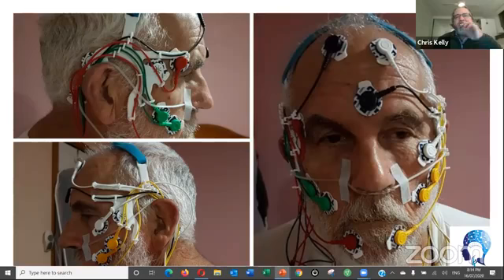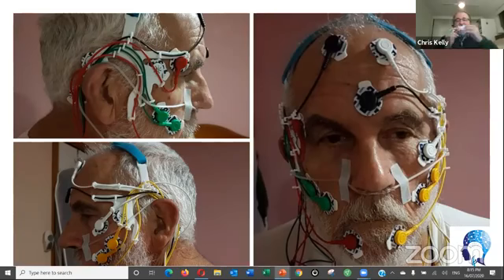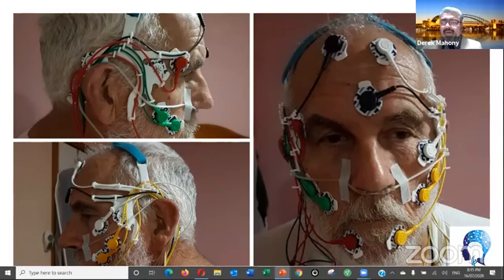When I sleep at night, my tongue just automatically, because I've been wearing these devices for a long time, now comes forward and sits in between the upper and lower pieces. So I actually put a bump on the front of my shield. Can you see that? Bump? Yep. And now when I put that in, my tongue can fit there. It's like a tongue stabilizing device as well as a tongue posturing device, because my upper jaw is actually quite far back on the base of my skull. So my tongue's not meant to fit in the top of my mouth, if you know what I mean. That makes sense? Yep, perfect.